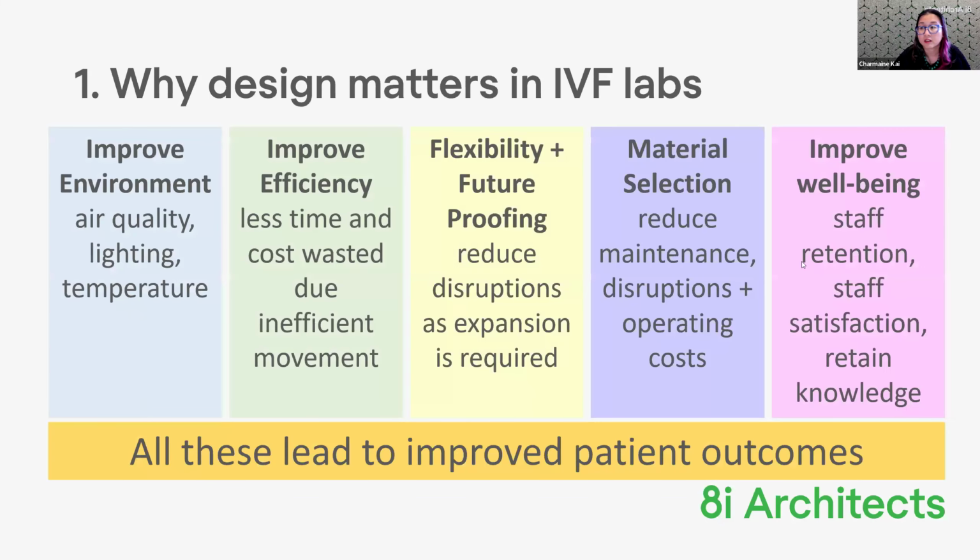So, first of all, why does design actually matter in an IVF lab? When people think about architecture, generally they think about the clinic space, the consulting room space, the lovely soft spaces that the patients actually use and go into, and not necessarily the IVF lab as the first thing that comes to mind that needs a really good design process.